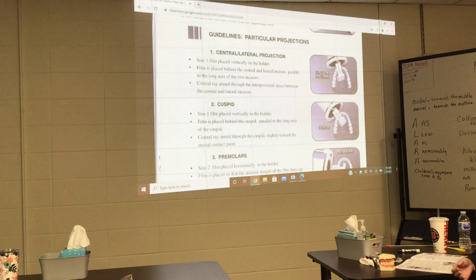I'm sorry, I'm trying to be a good person, good helper. Just relax and have them take a sip of water. And then as they relax, I have them take just one more sip of water, and not the whole cup, just a sip. What that sip does is it clears that gag reflex. When they swallow, it kind of moves everything back to where it was supposed to be, instead of being ready for it to happen again, and it's going to happen if you're in that situation.